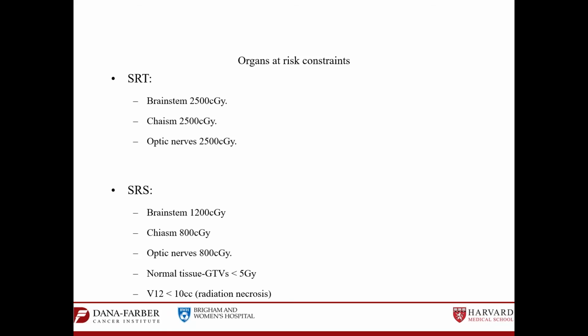Okay, and the other thing is when we talk about brainstem dose of 12 gray, is it the dose to PRV or is it the dose to brainstem? Sorry. So normally we draw PRV for the brainstem, PRV for the chiasm. Is this constrained with or without PRV?